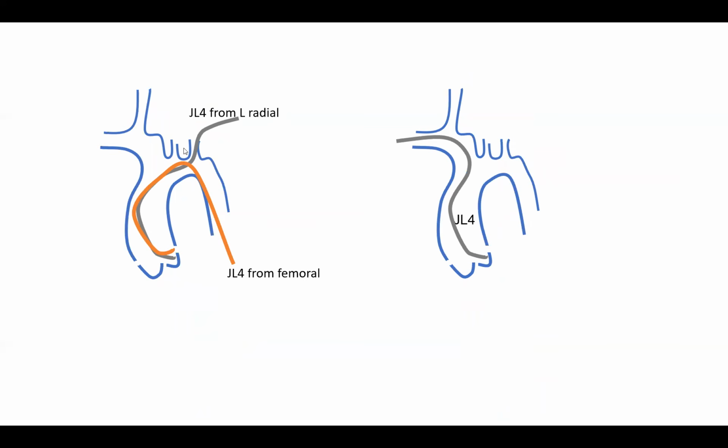I mentioned left radial. Left radial may elongate the catheters a little less because it has a less sharp turn at the innominate level. But left radial also elongates catheters in my experience. And in my experience, left radial has a similar caveat, and I tend to use a Judkins left 3.5 from left radial as well, similarly to what I do with right radial.